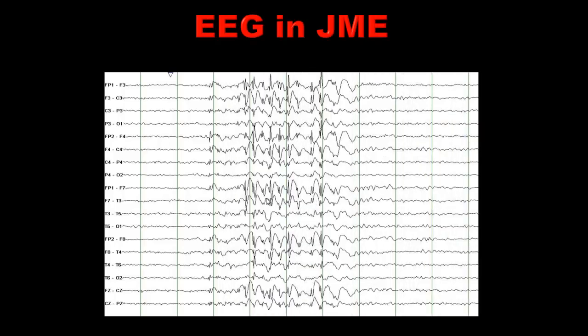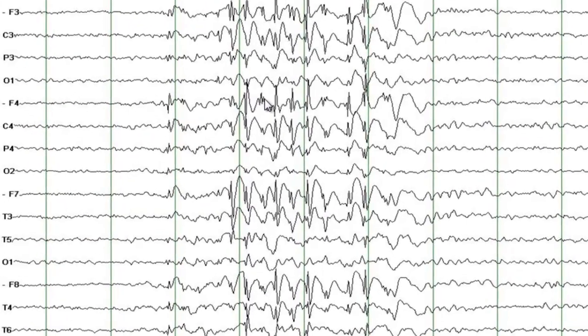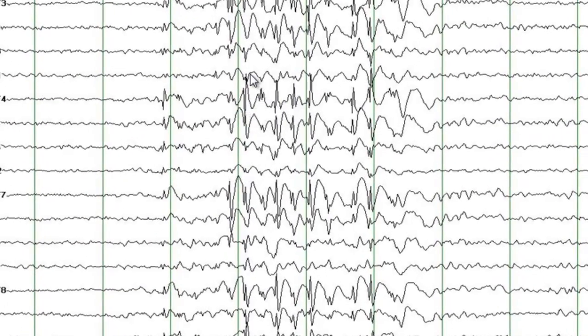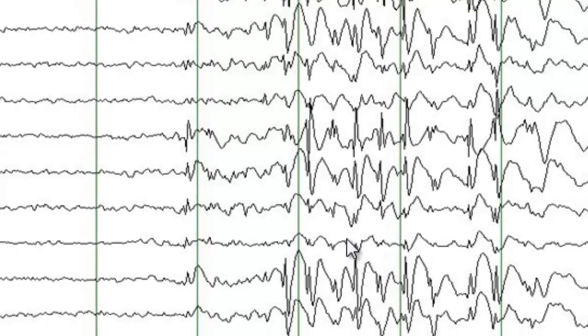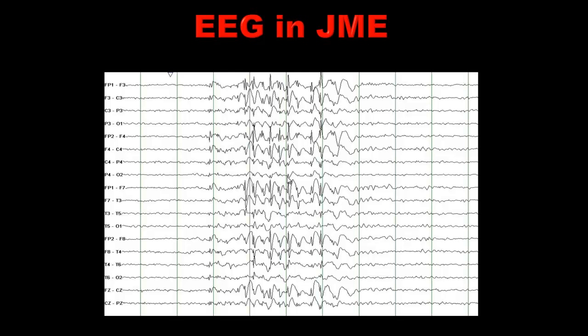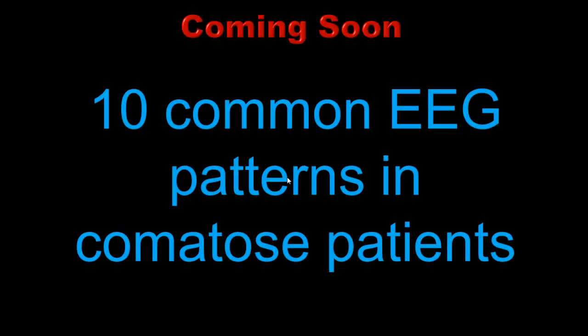The pattern here is generalized spike and wave and poly spike and wave discharges. If you compare this with the earlier 3 per second spike and wave slide, this is more irregular — it is 4 to 6 per second, and you can count multiple spikes in a single discharge — those are poly spikes. This pattern is often seen in association with juvenile myoclonic epilepsy. That's pretty much it for today. I will discuss other common EEG patterns in comatose patients in a future presentation. Good luck with your exams. Bye for now.